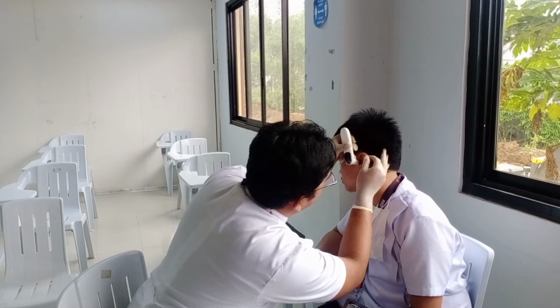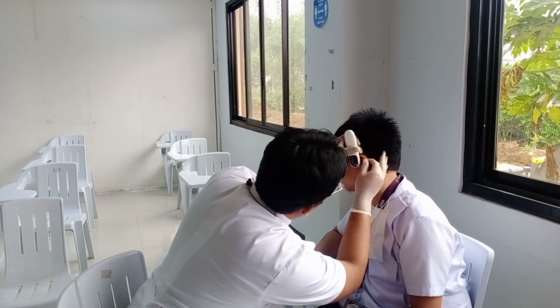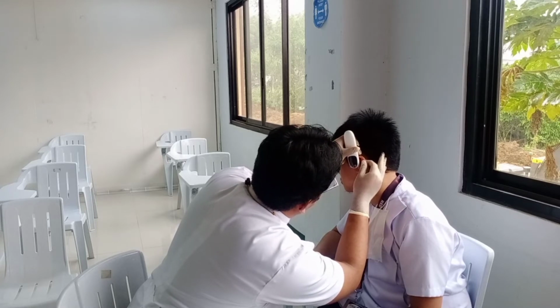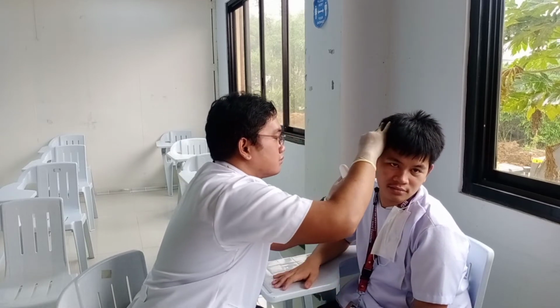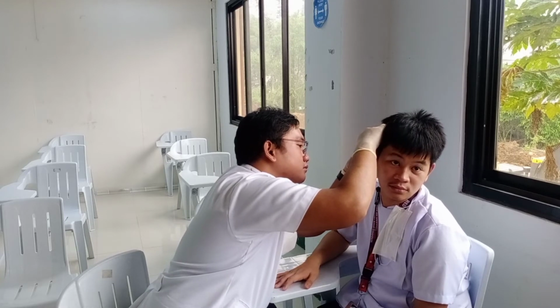Insert the speculum slowly about 1 to 1.5 cm into the ear canal. This is because the inner two-thirds of the canal is bony, and the speculum pressed against the bony side will cause the client discomfort. Inspect the tympanic membrane for color and landmarks. Deviation from the normal color may indicate trauma or infection.